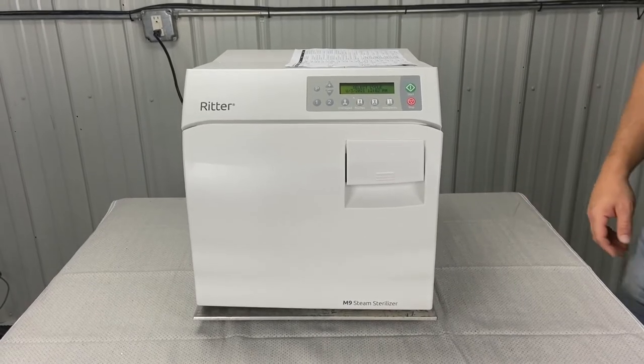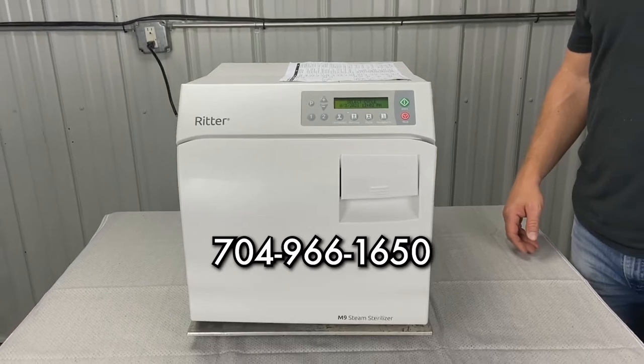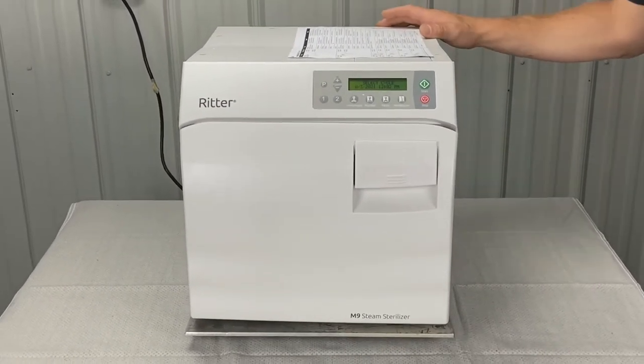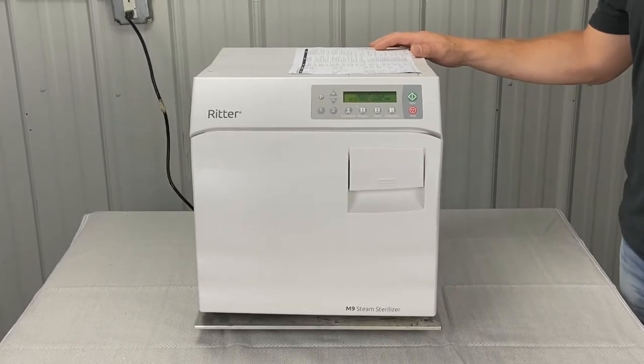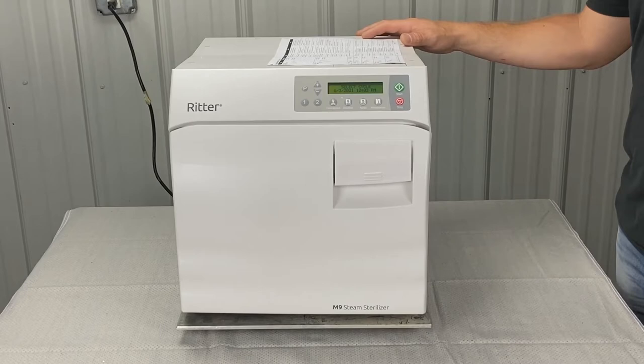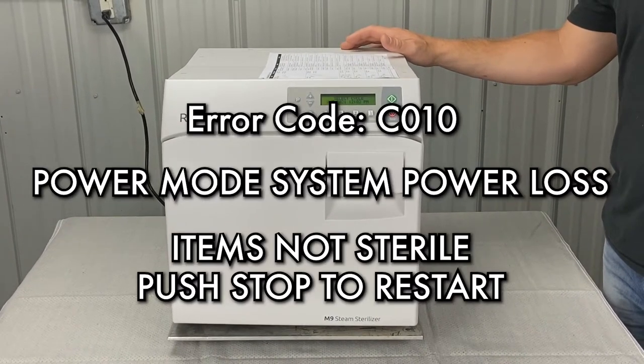Andrew here, Sterilize Zero Autoclave Solutions, 704-966-1650, option three for free technical support. Right here we have a Midmark M9 new style — this is actually brand new. We're going to review the error codes. We're going to start with error C010.